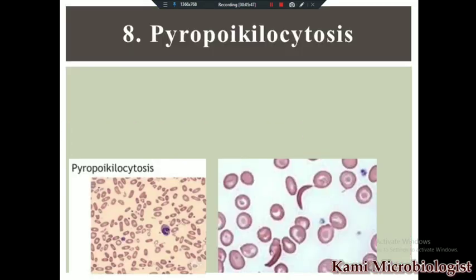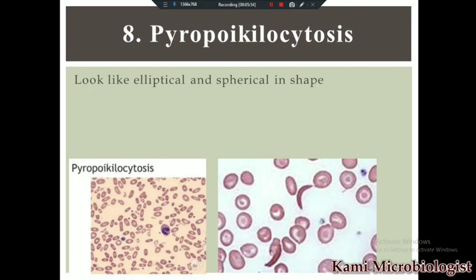The eighth type is called pyropoikilocytosis. Pyropoikilocytosis means when the RBCs look elliptical or spherical in shape. As you can see in the images, some RBCs are elliptical and some are spherical — this is called pyropoikilocytosis.